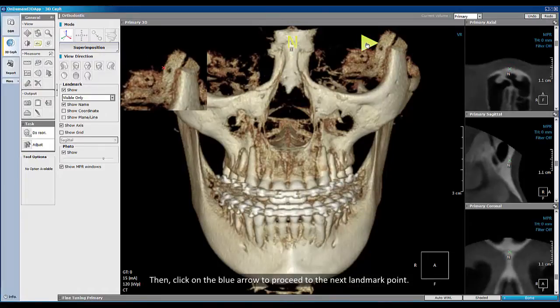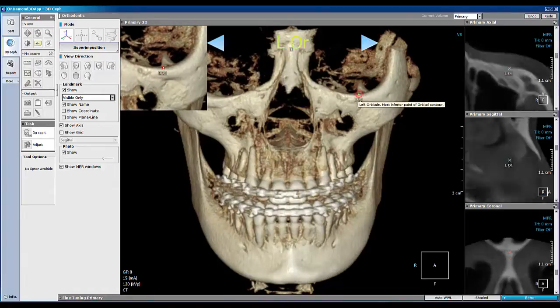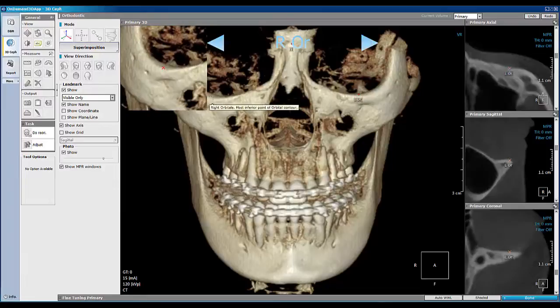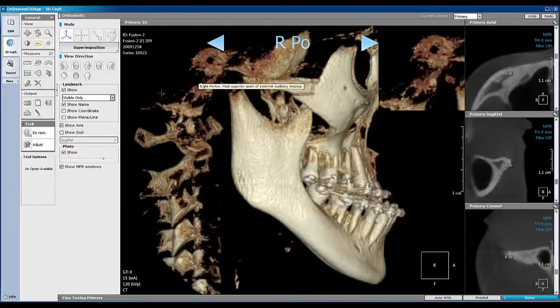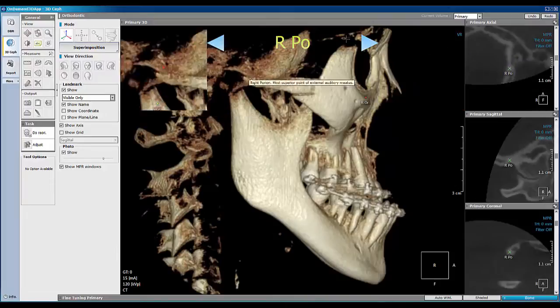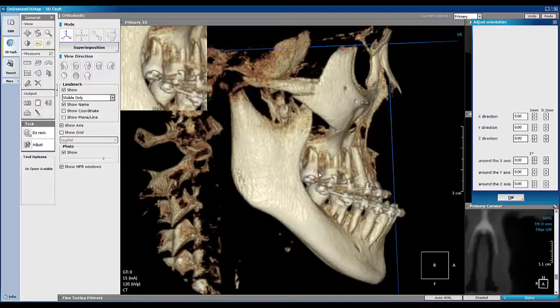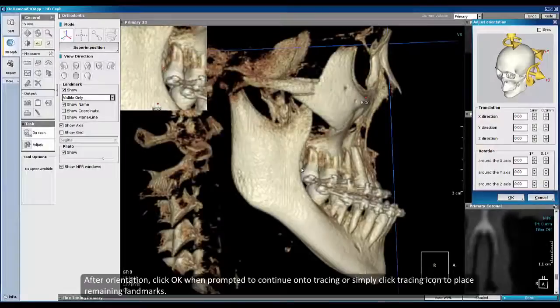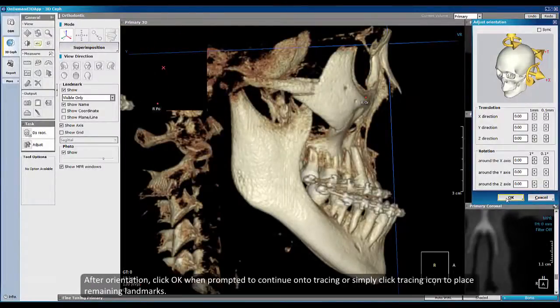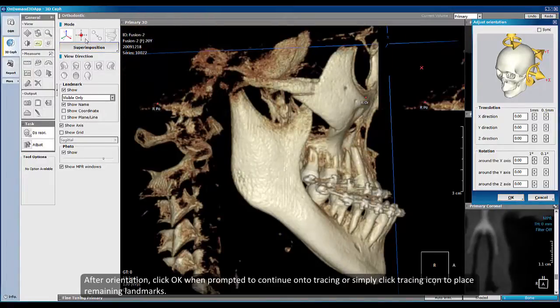Click on the blue arrow to proceed to the next landmark point. Once finished, a confirmation window will pop up. Press OK to proceed with auto-reorientation. After orientation, click OK when prompted to continue on to tracing, or simply click the tracing icon to place remaining landmarks.